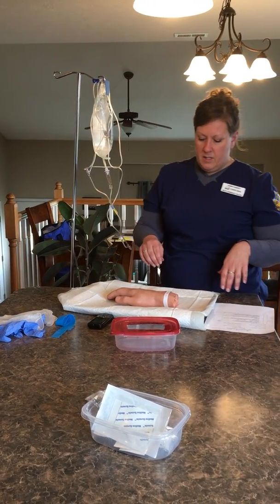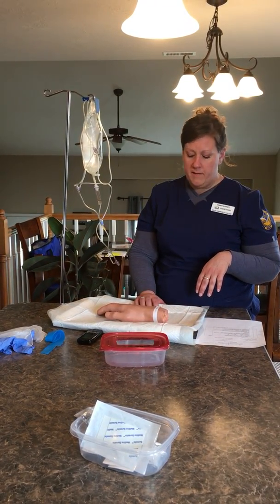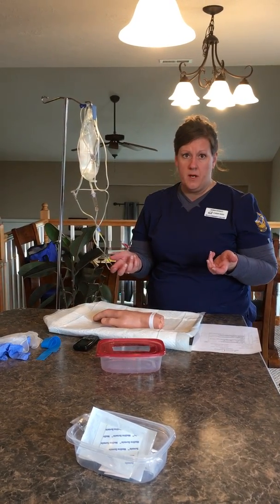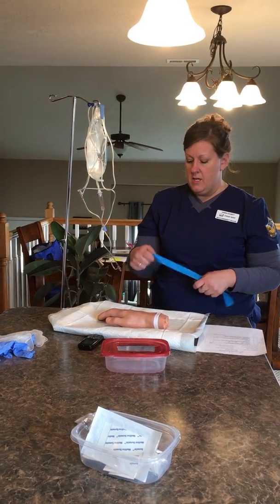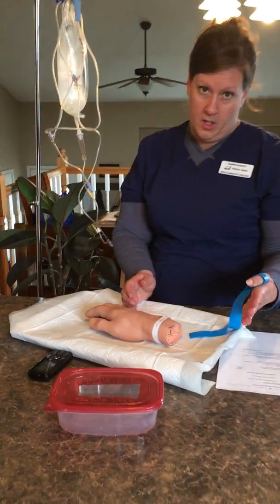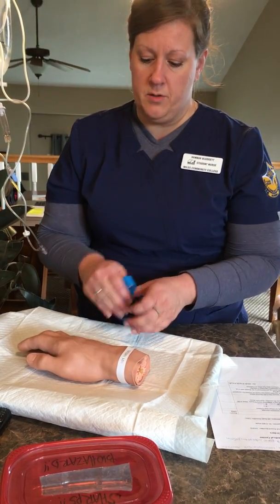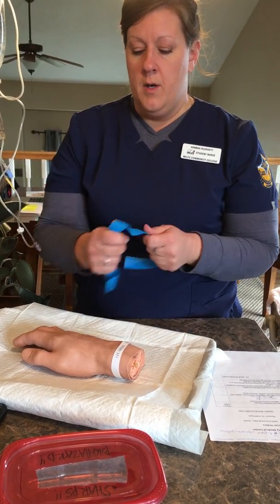All right, then I would educate the patient on the procedure we'll be doing today, which is starting an IV on them. I would first go in to palpate, check out the vein, and see that we've got a good location. On a normal arm, the arm would be longer, and you would put the tourniquet about 5 to 6 inches above where you're going to start the IV. In this case, it's a little closer than I need to, but we're going to work with it.